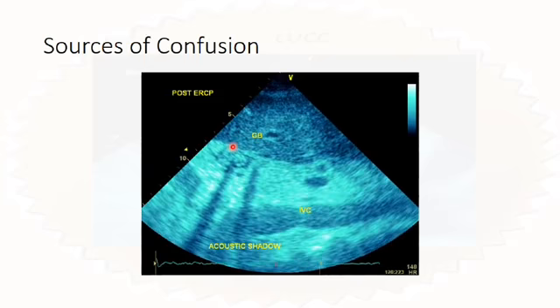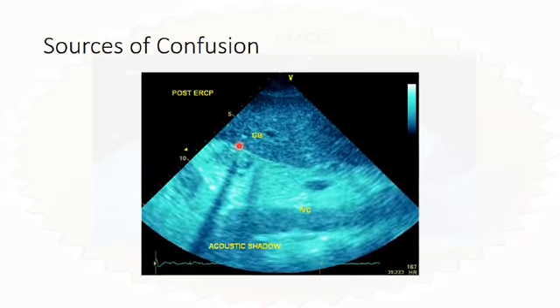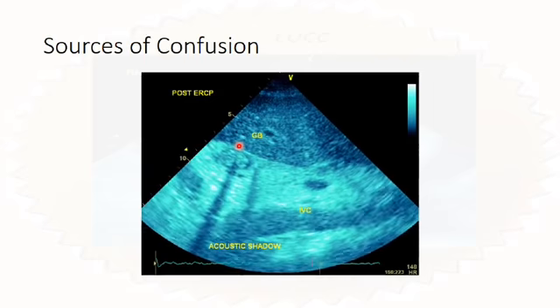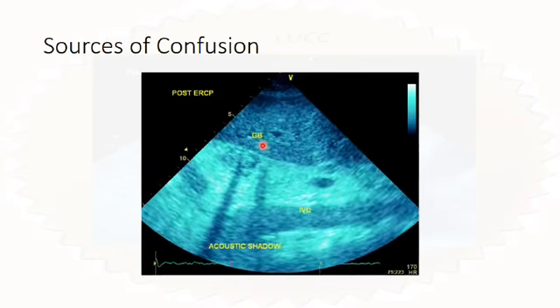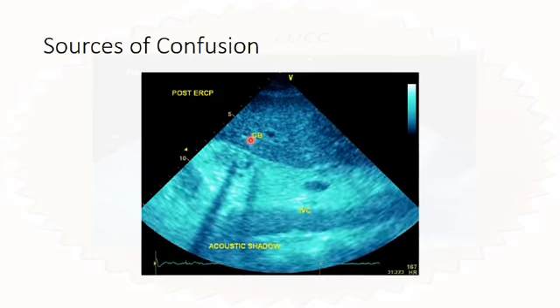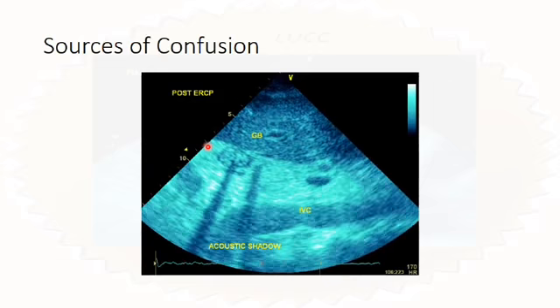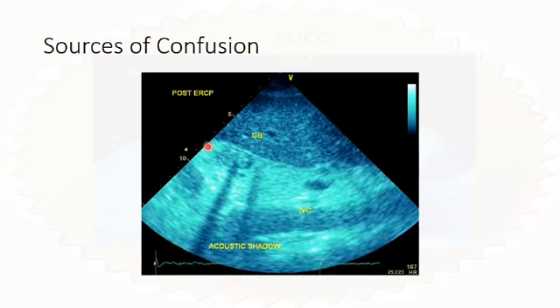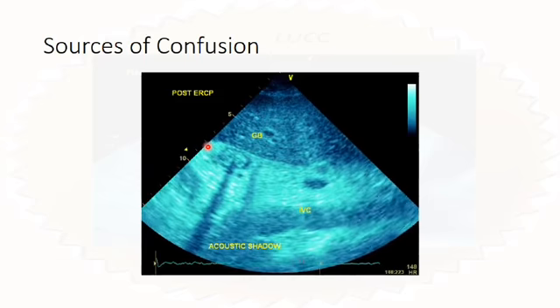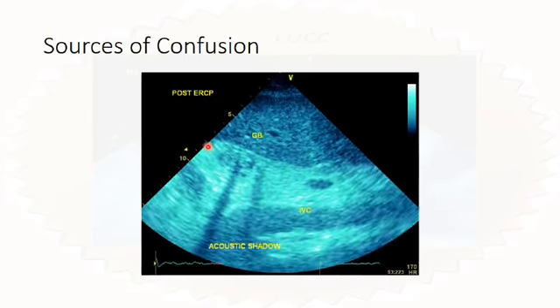It has this hyperechoic lesion within it, which is casting some acoustic shadowing. I said these are all acoustic shadows, and therefore, in a patient who's post ERCP for stones, I said that this was a gallbladder stone, except it was not. I was looking at a completely wrong structure. This is actually the loop of bowel.